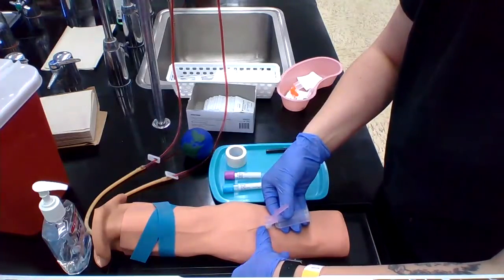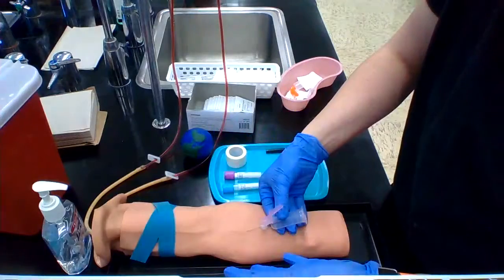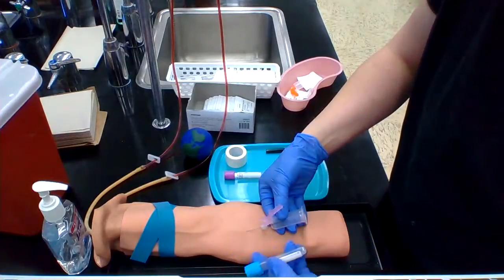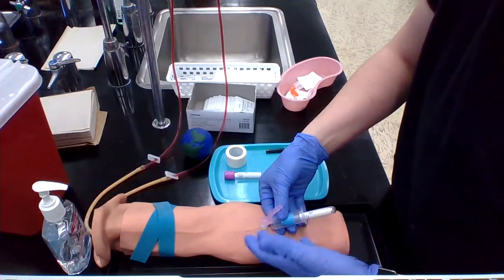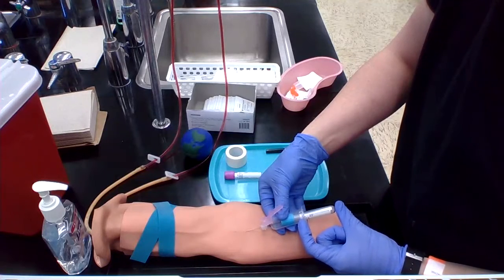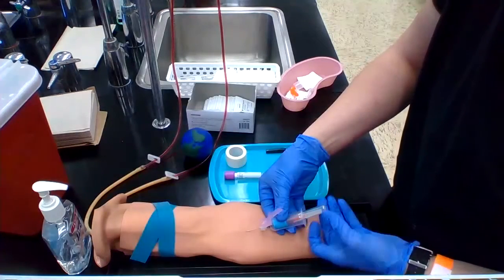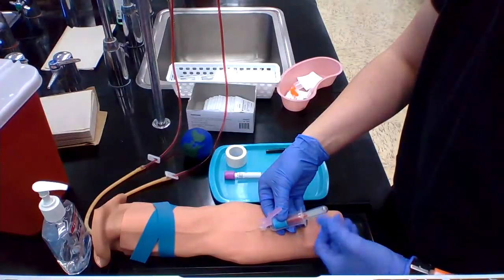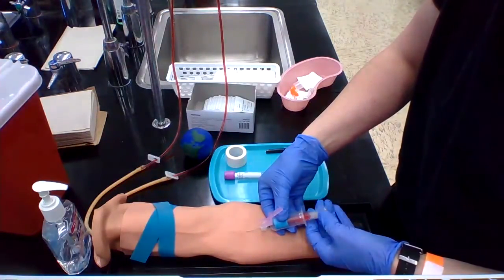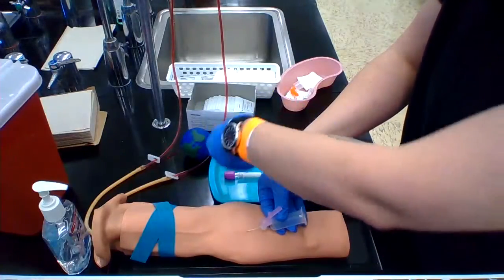Don't touch the site after you've cleaned it. Once you're at the site, you want to go straight in gently. You don't want to hesitantly poke because that can either nick the vein and cause your patient to bleed unnecessarily, or you'll contaminate your needle with bacteria from the skin, which can get into your sample. Once you're in, hold this hand really steady and use your other hand to grab your tubes — hold the back of the tube with one or two fingers on the flange — and press your tube into your holder without jostling the holder, because that needle is very sharp and can cut tissue.